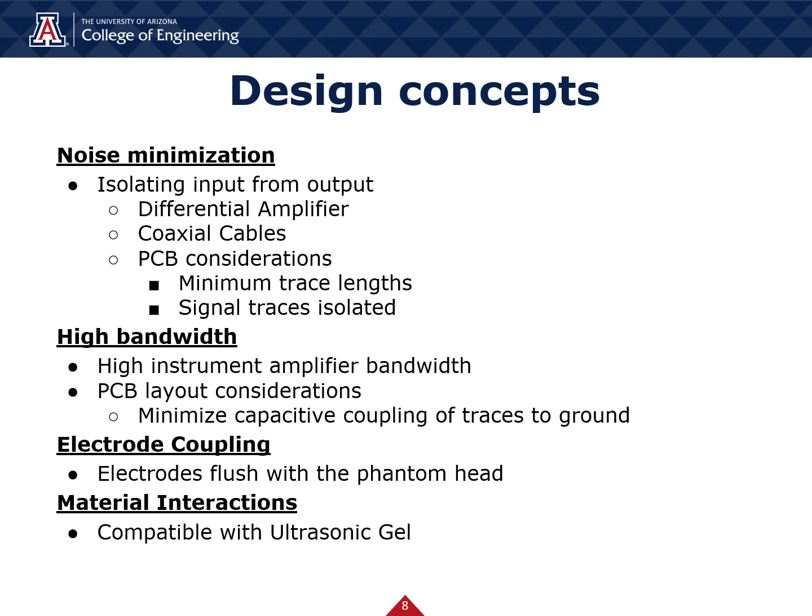The second major design concept was the high bandwidth we were working with. There was special consideration when selecting the high bandwidth instrument amplifiers we would be using, as well as improving our PCB layout in order to increase the bandwidth of the circuit. Our electrode coupling was also crucial. To ensure the electrodes would stay flush against the phantom head, we implemented a housing and clip for the electrodes. Finally, we had to keep in mind any material interactions that might occur, specifically with the ultrasonic gel and head cap material.